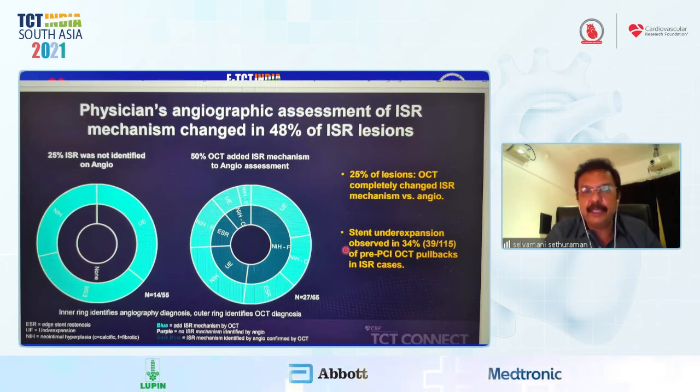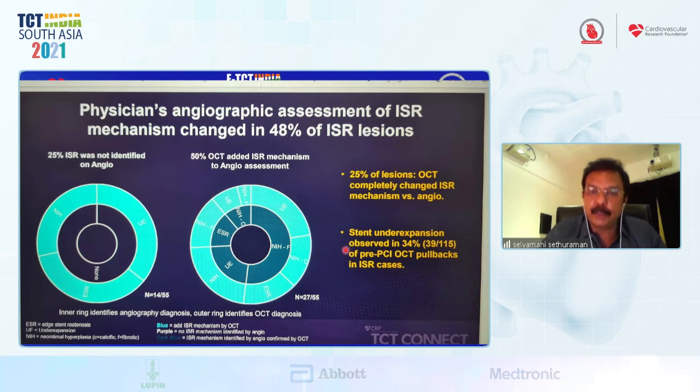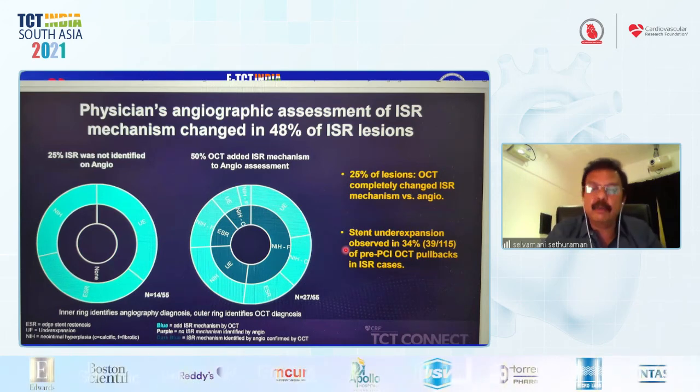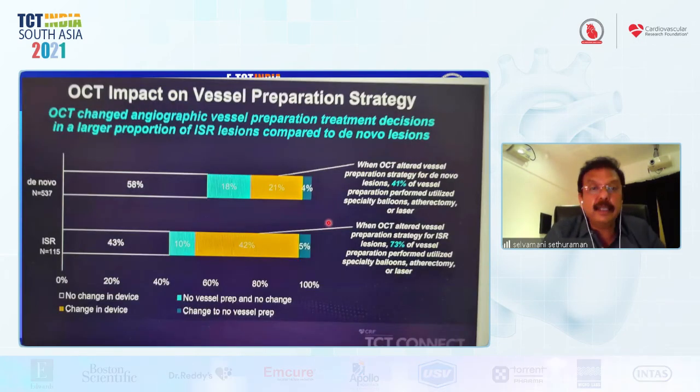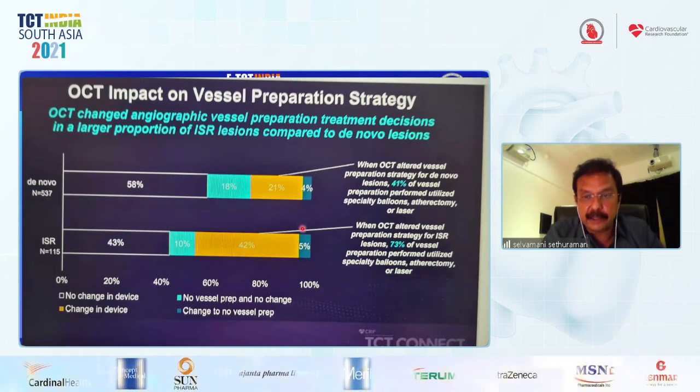This Light Lab initiative is from the US. We also did a similar study called the IOPTICO study in India, which has also given similar results. But here, it is an ISR subset analysis, and the impact of vessel preparation strategy.